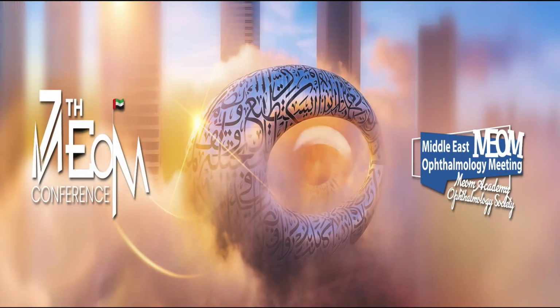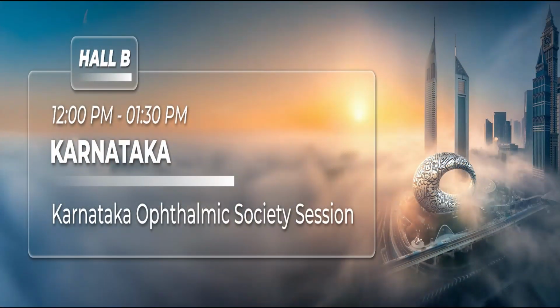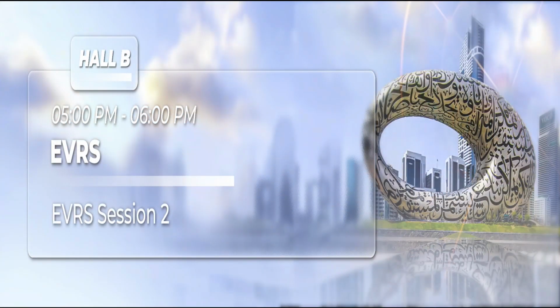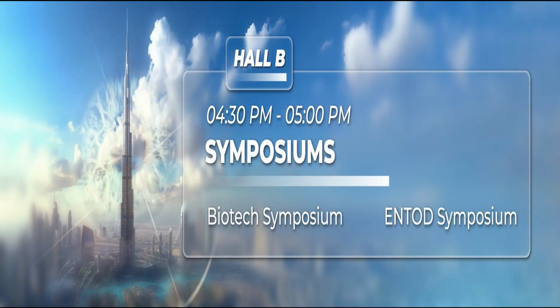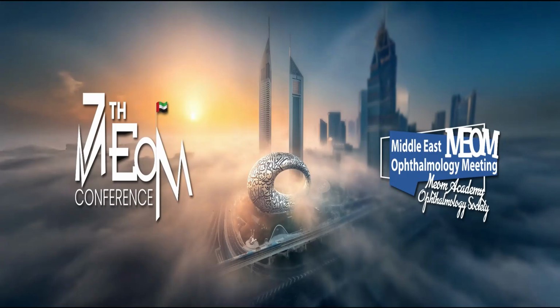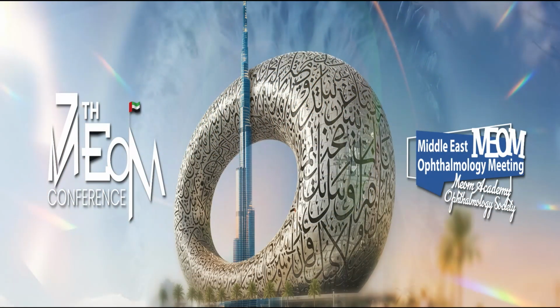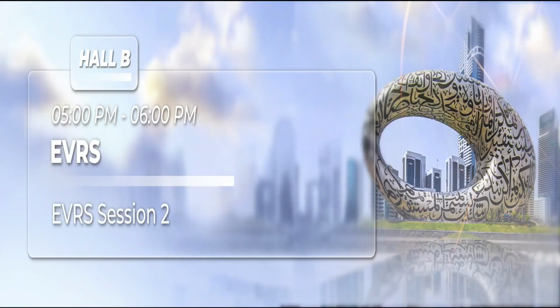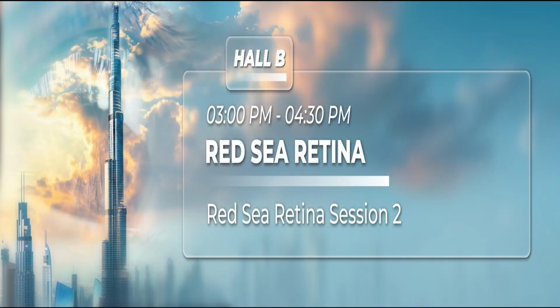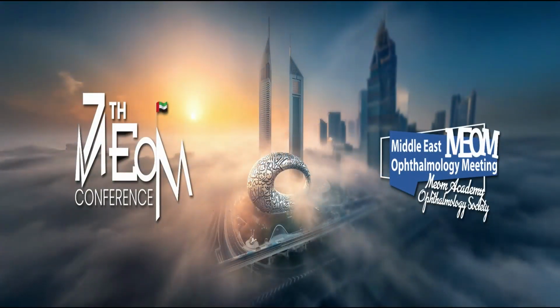Please, I want to add something about this technique for exchange. Beautiful surgery, but I want to inform you that for all cases you can use PFCL exchange by air, for all patients with the GRT with or without PVR.